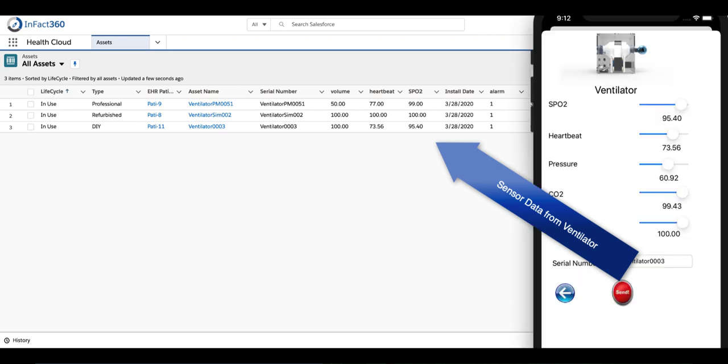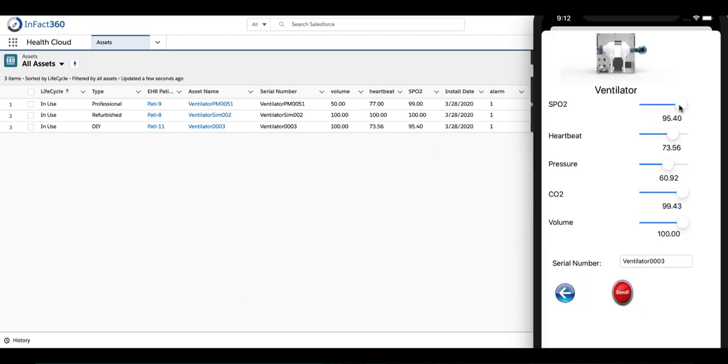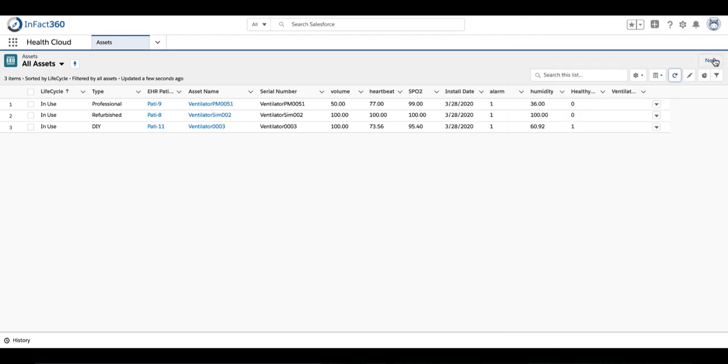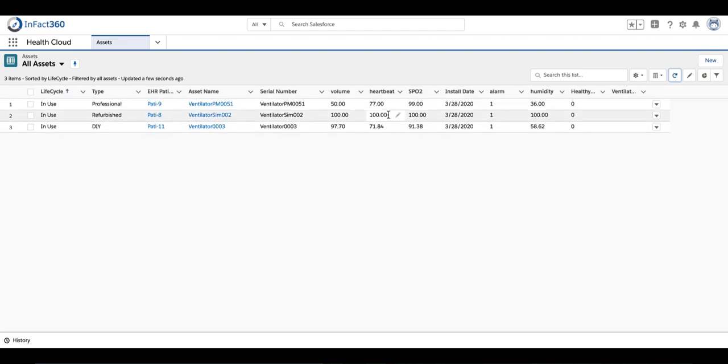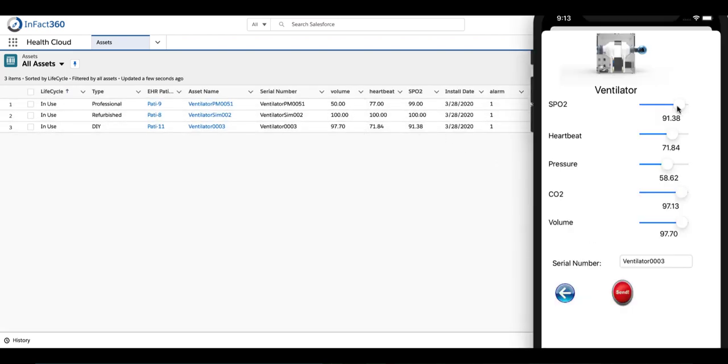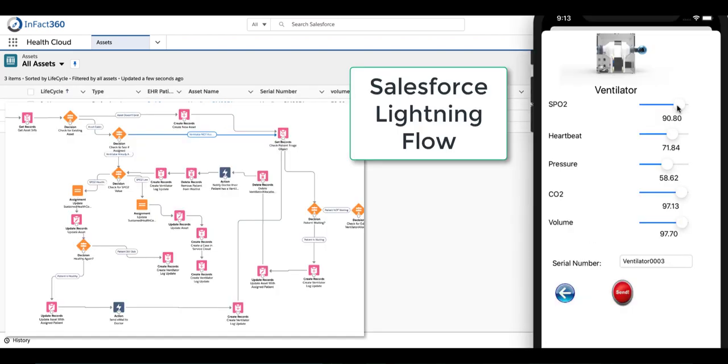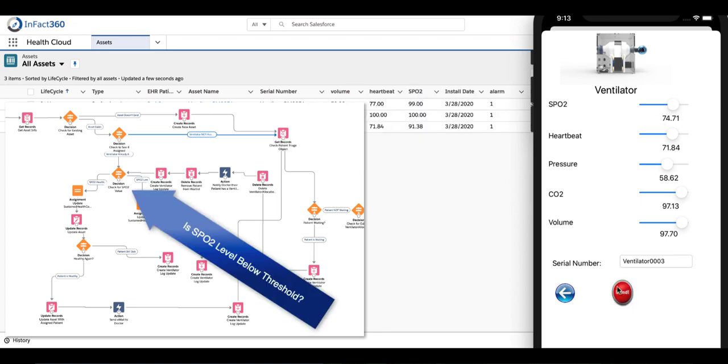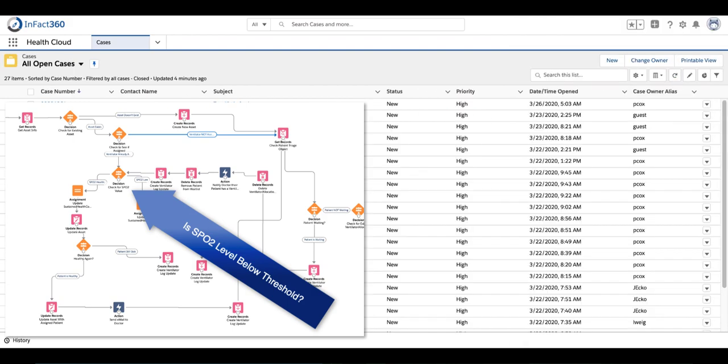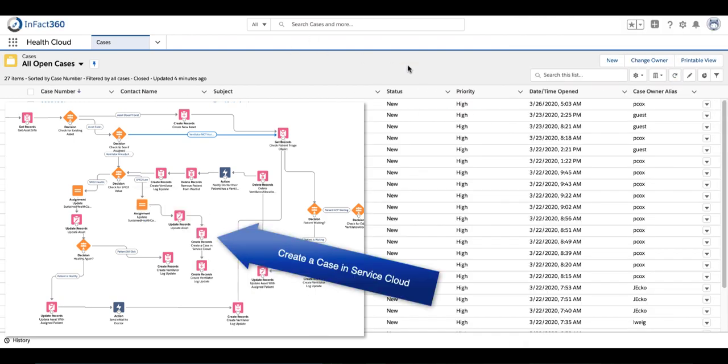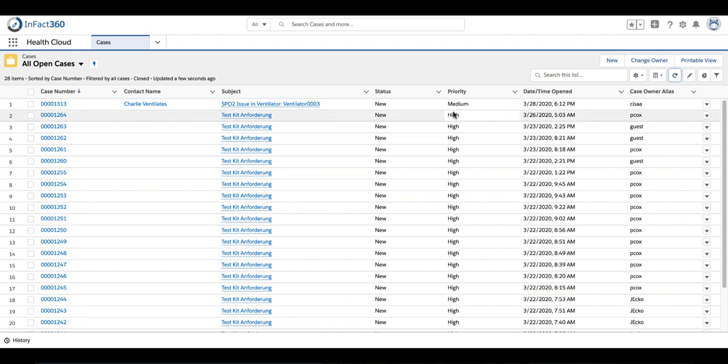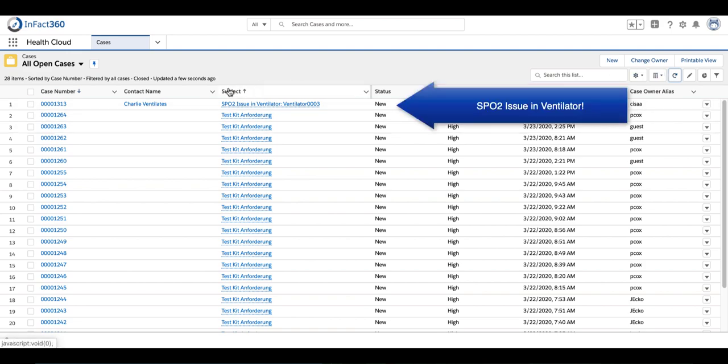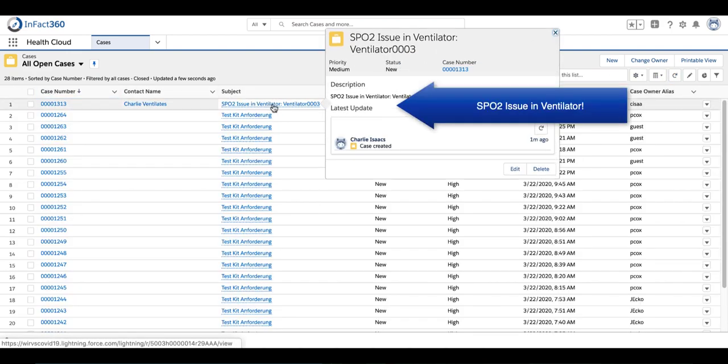So now if we drop the SPO2 levels and change some of the other levels in the simulator, we can see that all the information is updated in the Salesforce asset record. Next, what we're going to do is simulate a problem in the patient. We're going to drop the SPO2 level down below the threshold. In the Salesforce Lightning Flow, there's a rule that says if the SPO2 level is below the threshold, then we're going to create a case in Service Cloud.